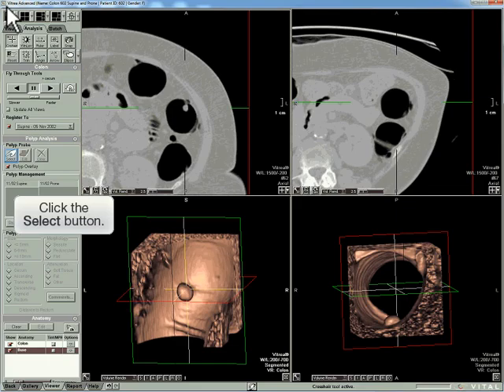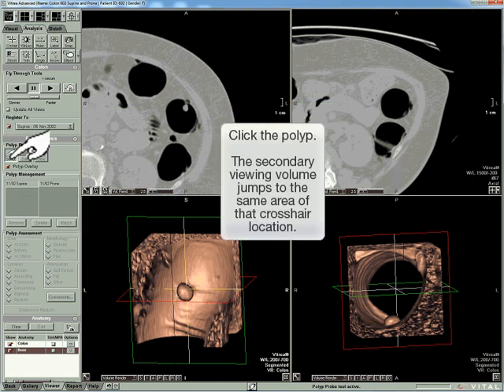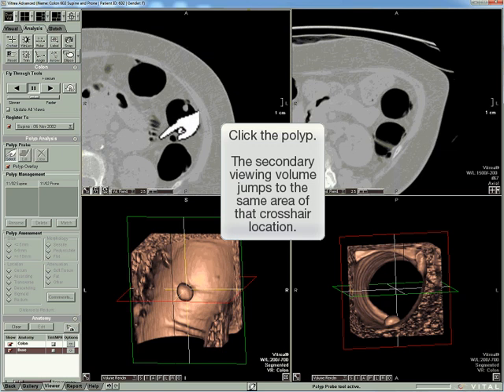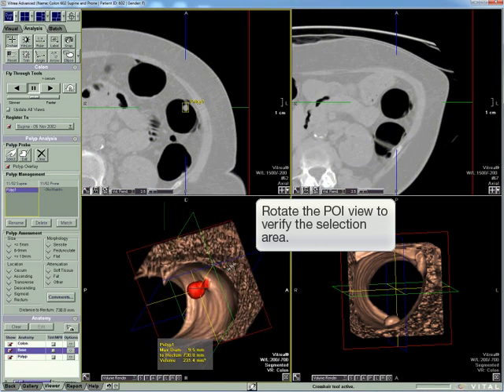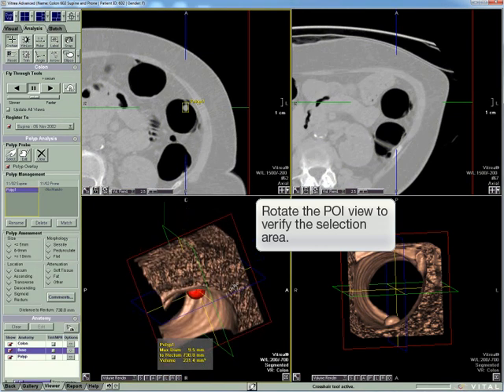Click Select. In the controlling dataset, click the polyp. The secondary dataset jumps to the area of the same crosshair location. Rotate the POI view to verify the selection area.